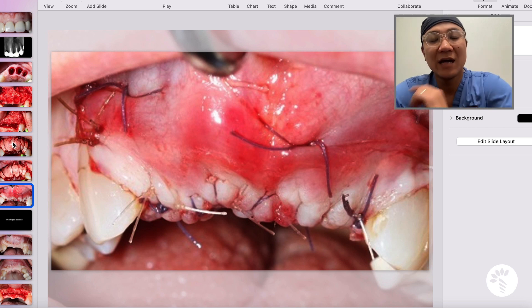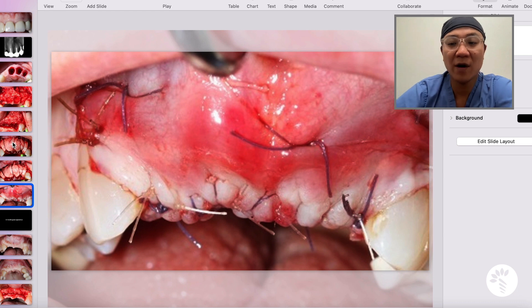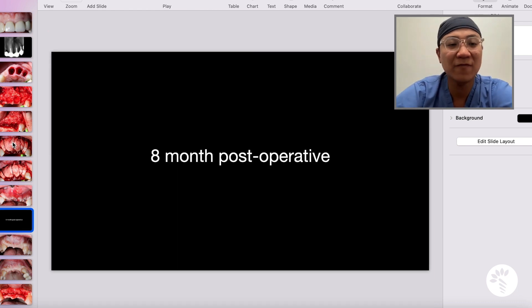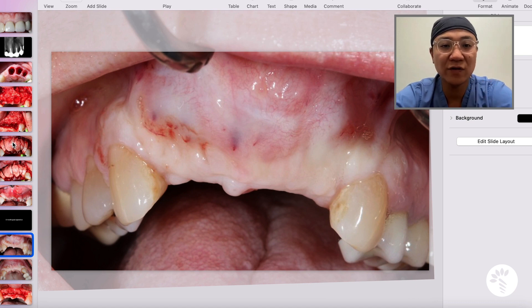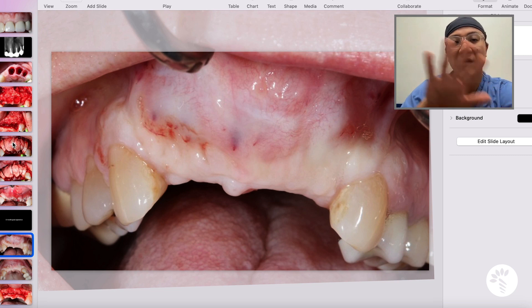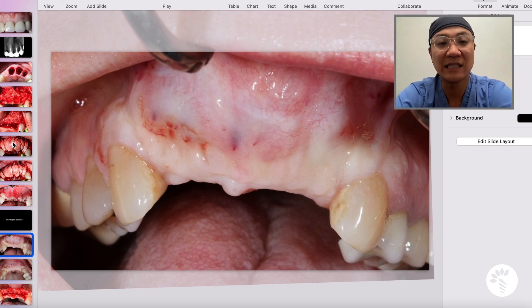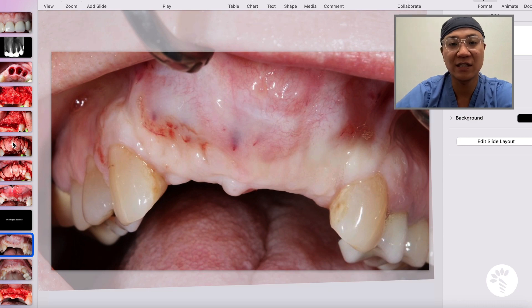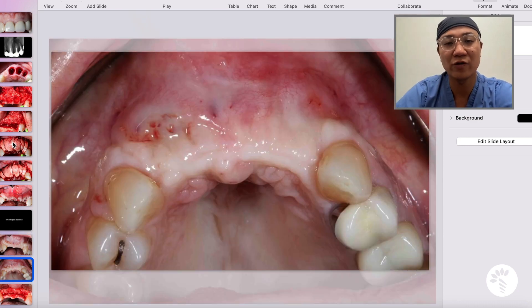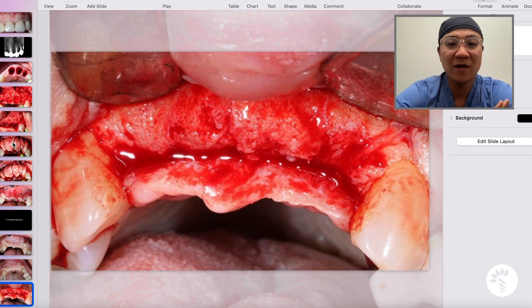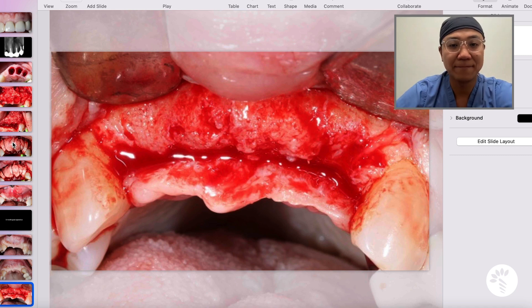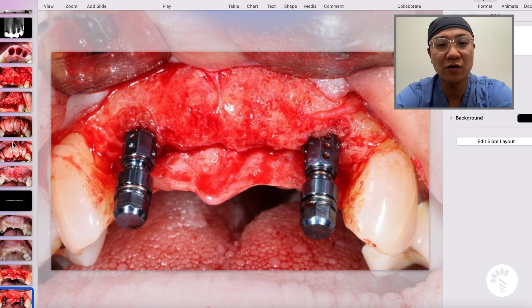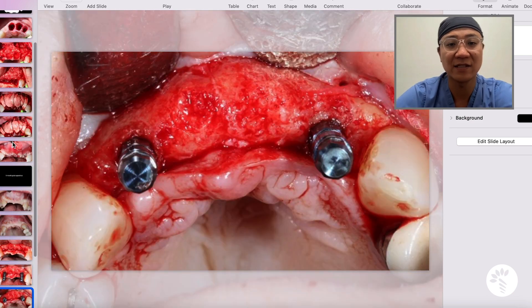Now I had to wait for osseous healing for a minimum of six to eight months. At the eight-month follow-up, this is how Joanie presented. You can see the soft tissue healing looks really nice, and you can appreciate convexity on the maxillary incisor area. This is the occlusal view. After making an incision, you can clearly see a wonderful outcome of bone regeneration in the area. Based on the surgical guide, I placed two implants on the lateral incisor areas — this is the occlusal view.